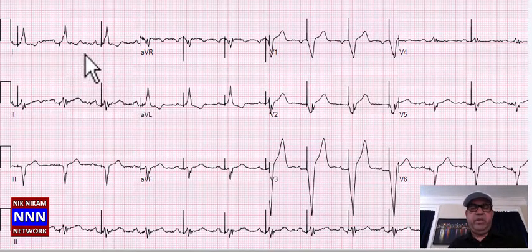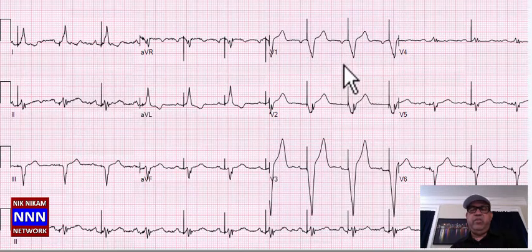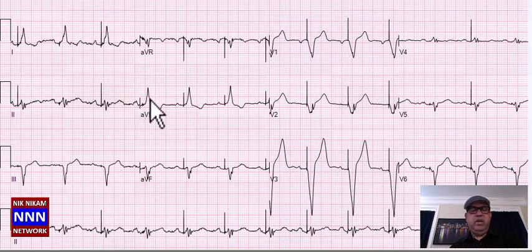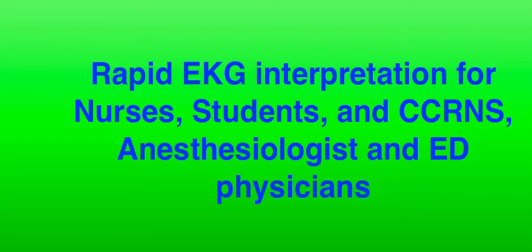This is a pacemaker rhythm — ventricular pacing, atrial sensing — and that is about it for this patient.